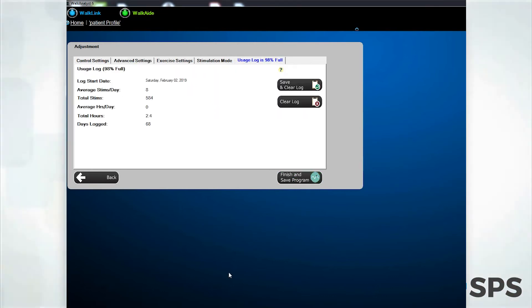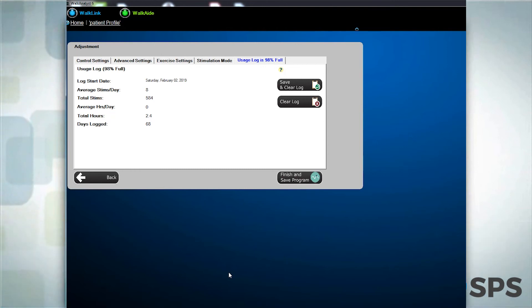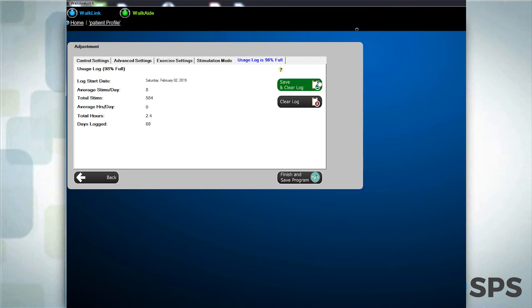The usage log tab indicates the percentage of the usage log capacity that is full of recorded walking data. If the percentage is high, select this tab to retrieve and clear the usage log so that additional data can be collected.